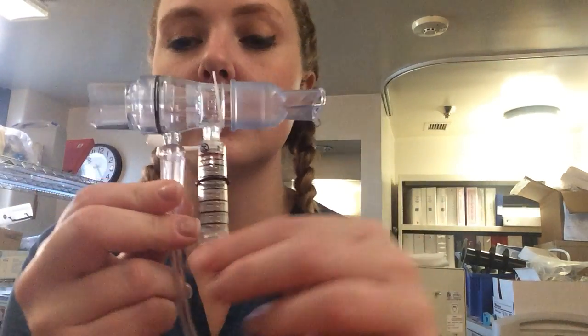I am going to be doing a lung volume expansion therapy on a patient. Today is going to be an EC-PAP, and this is the device.